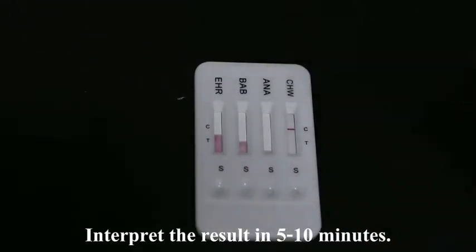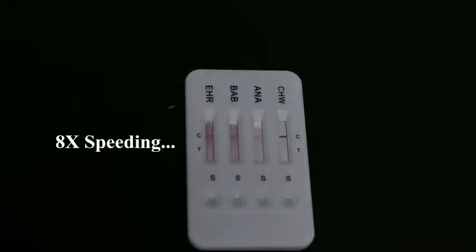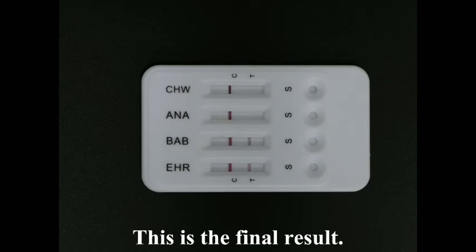Interpret the result in 5 to 10 minutes. A result after 10 minutes is considered invalid. This is the final result.